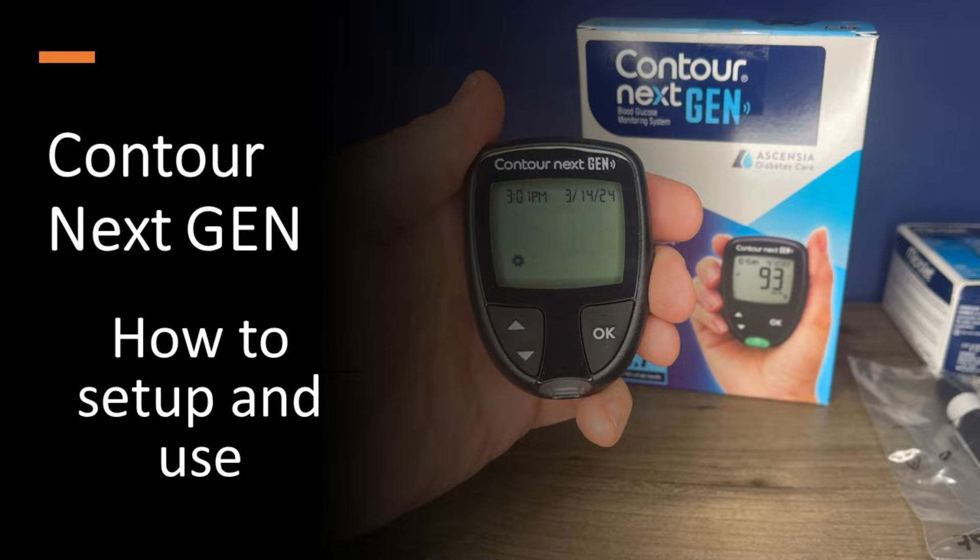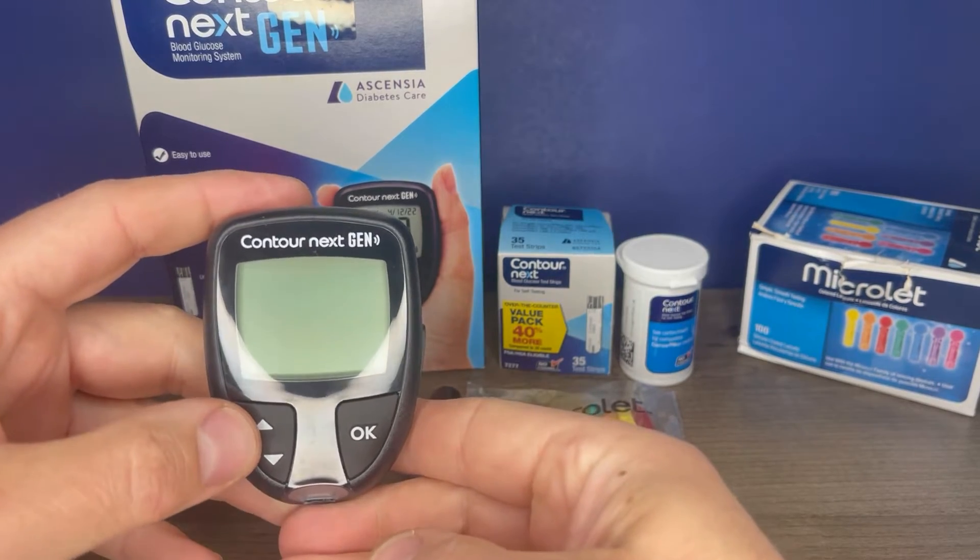Hi, this is Josh. I'm a pharmacist with Learn Blood Sugar Testing. I'm going to show you how to set up and use the Contour Next Gen Blood Glucose Monitor.